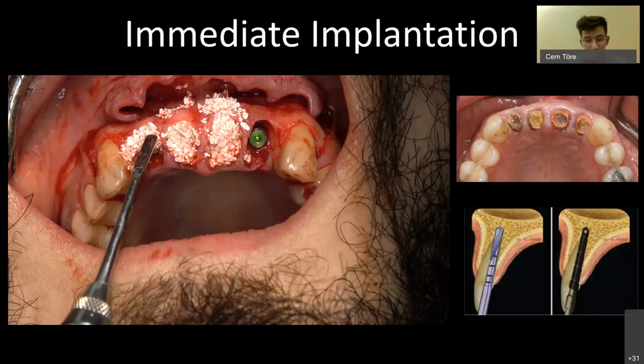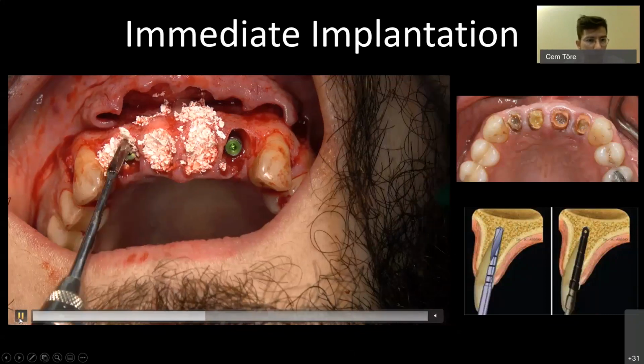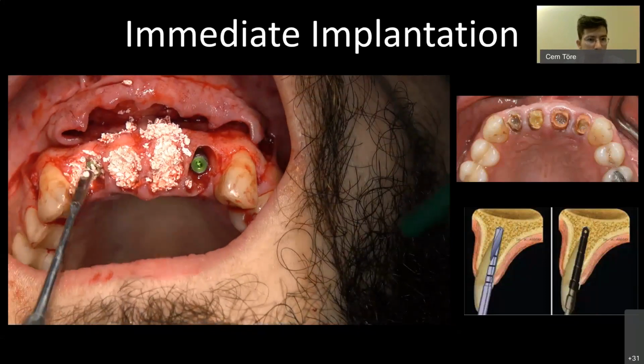like the one you use to shape composite resin, for example, for fillings, or another filling tool, which is the excavator, which is essentially a very tiny curette, but with a hemispheric section, which is the same shape as the section we have here. So you can use those tools to compact the bone after immediate implantation.